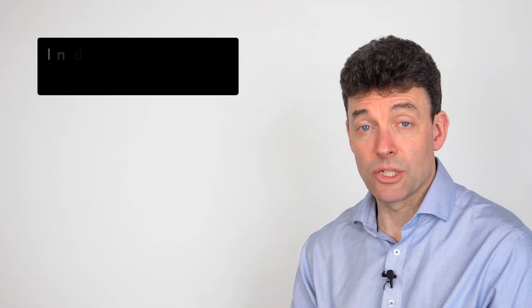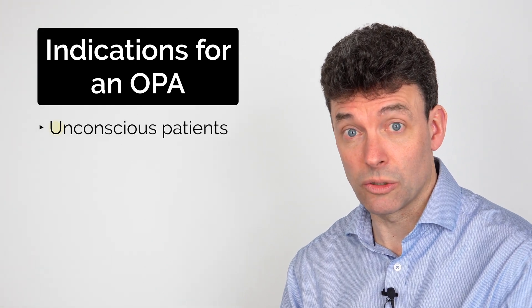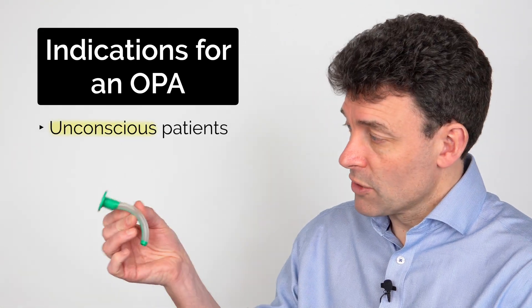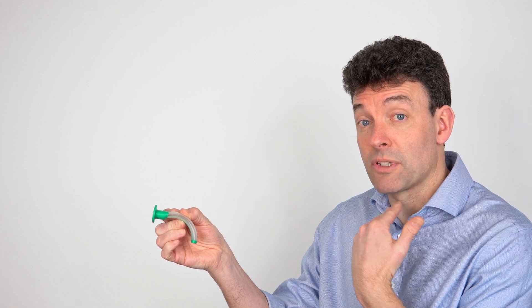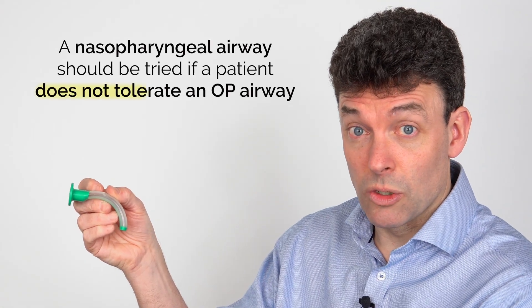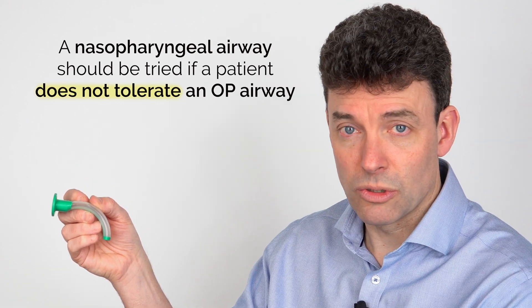The best indication for using an oropharyngeal airway is if you have a patient who is unconscious. Because of where this sits in the airway, this hard plastic bit at the back is going to sit on the oropharynx, so if you have someone who's awake enough to have a gag reflex they aren't going to tolerate this going in. If the patient isn't tolerating this, then a nasopharyngeal airway is also a good option.